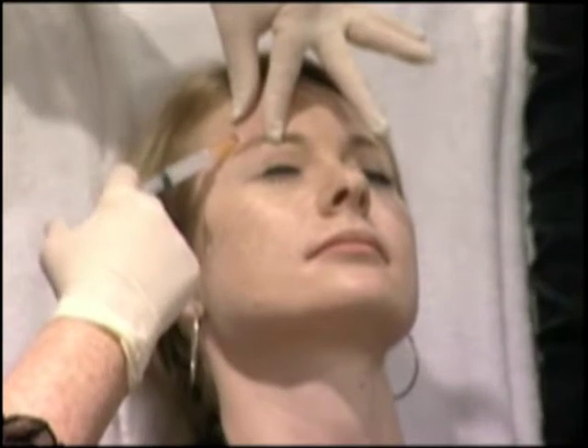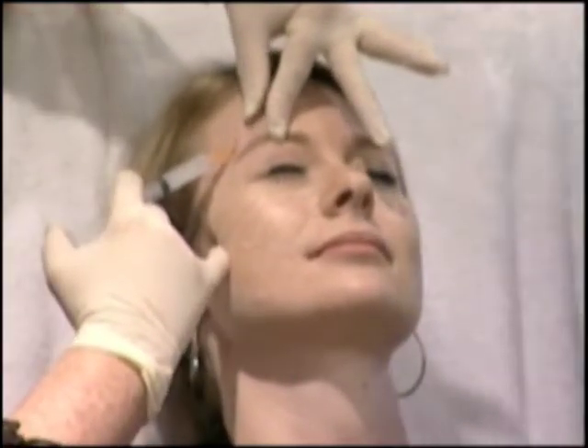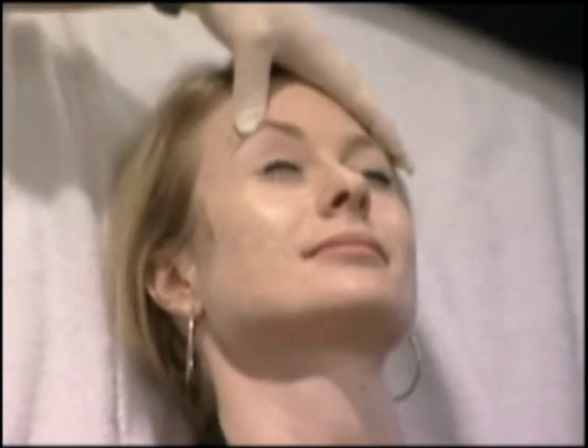Thanks for doing that both ways. It was a great demo. And then just inject as you come out. That was good.